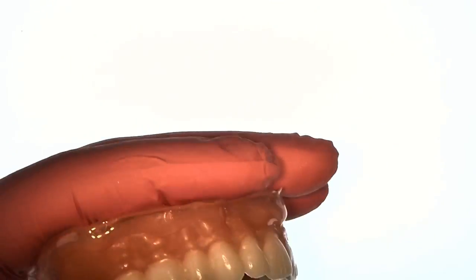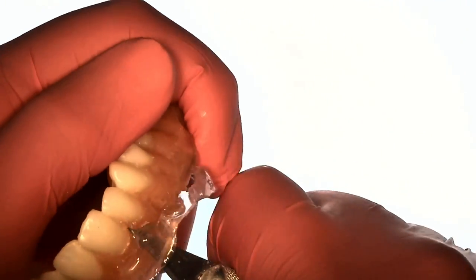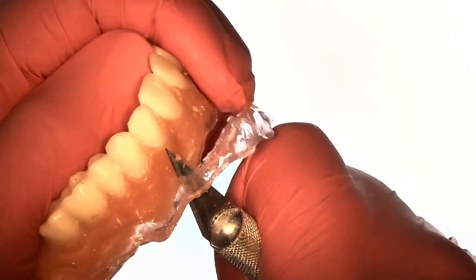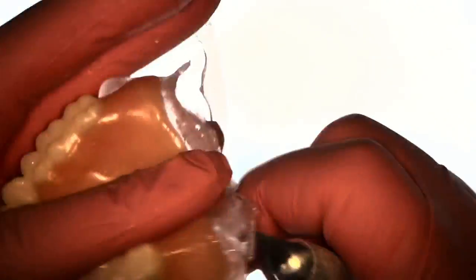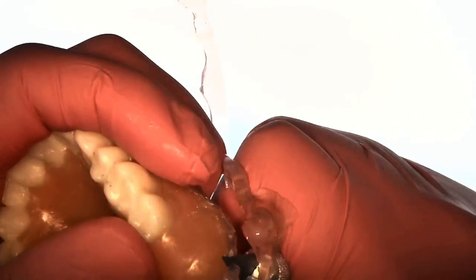This then is going to go to the mouth and you're going to do functional reline. So you have the patient close down and you do your border movements. I do that for about five minutes. I pull it out of the mouth and I let it set up for 10 minutes extra. So again that's what I do. It's about 15 minutes, five minutes in the mouth of border movements, 10 minutes on the bench.